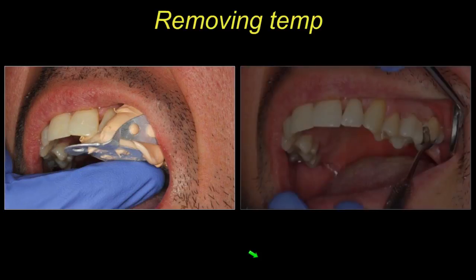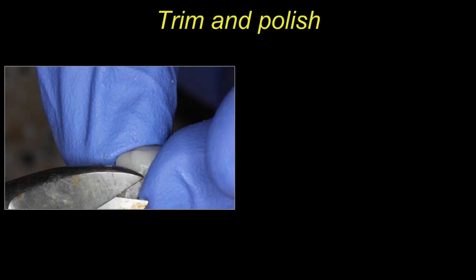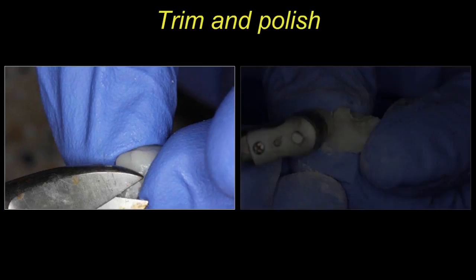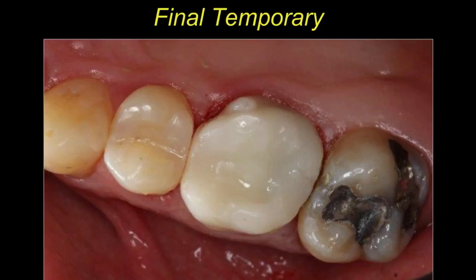Seat it in — teeth around it hold it in place, keeping it secure and not letting it rock. In this case, the matrix came out and the temporary stayed in, which is fine. I'll carefully tease it out and check for undercuts. I typically don't trim right away — I let it set for another minute inside the matrix, then take it out. Using crown and bridge scissors to trim, then a disc to polish. I verify the occlusion and spend more time on anterior provisionals to ensure aesthetics are absolutely perfect.